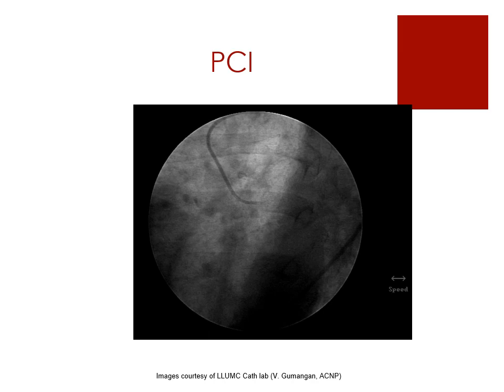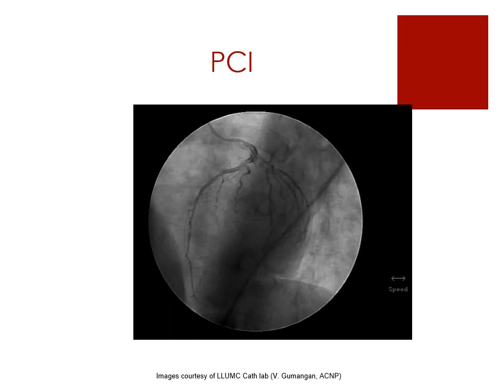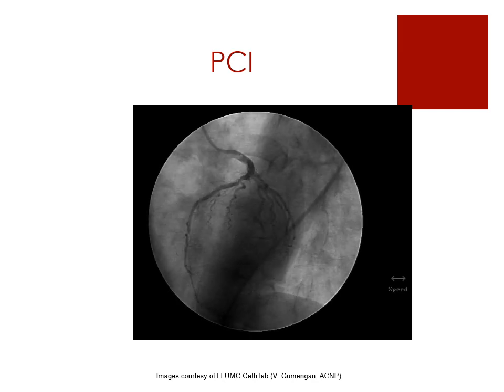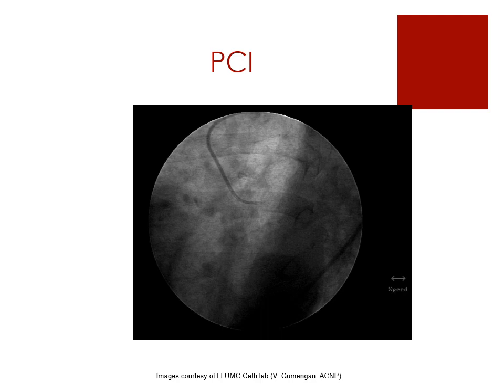Cardiac lab, and she gave me this video. Just watch very quickly. Look at that. So this is an actual cardiac cath on there. You can see how it reperfuses, and it opens very, very quickly. So that's the beauty of having that. It just opens it right up, and notice how that circulation now reperfuses the heart that didn't have that circulation before.